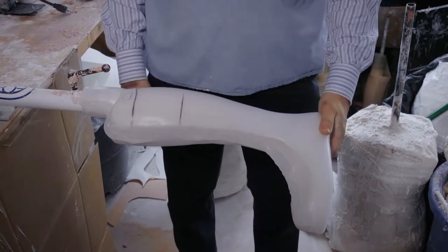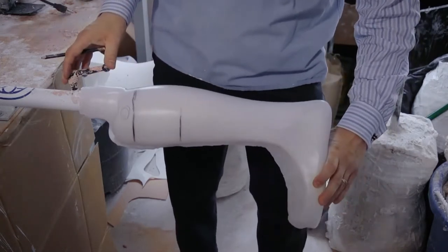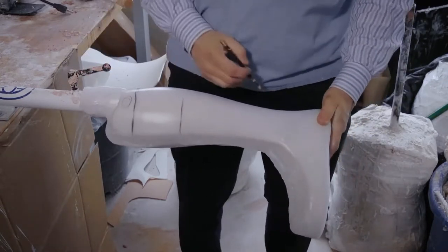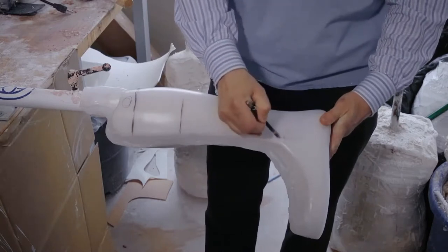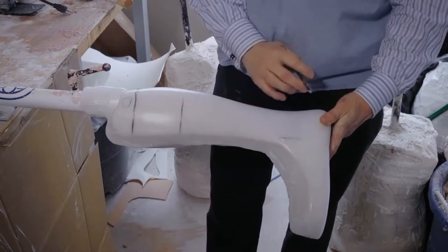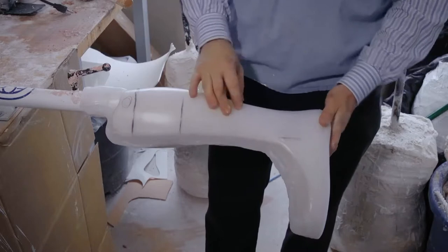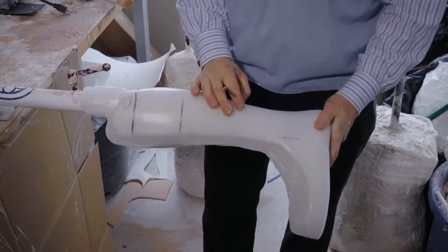There are different styles of AFOs that we've touched on in these videos, and I'm going to show you what we mean by the different styles. If I have more plastic here, the brace gets stronger at the ankle. If I have less plastic, meaning I trim the brace back here, the brace is going to be a very different kind of brace, and the effect will be different. So I'm going to start from the back.